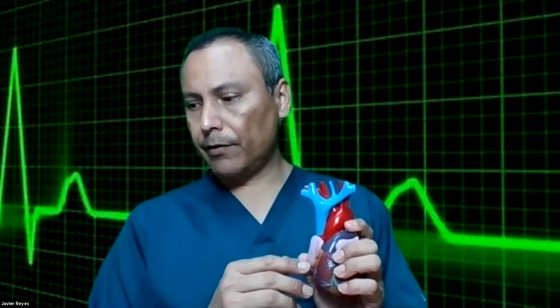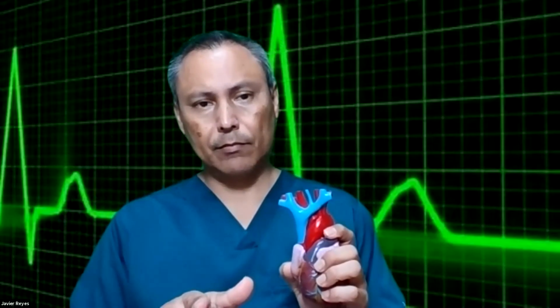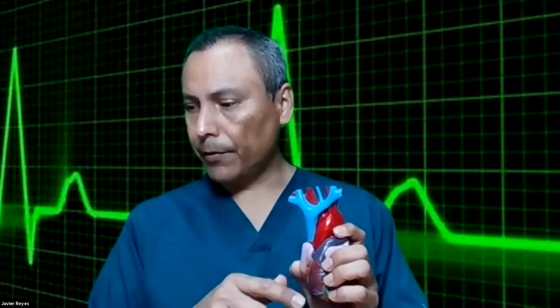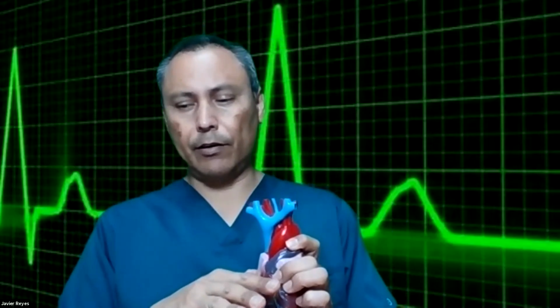So is the rhythm going to be regular? It should be. The P to the P and the RR should be regular. Get your calipers, measure it regular. The rate should be between 60 to 100. The rate should not be affected. If it's affected, then we're dealing with another kind of block. We'll go into it. The P wave morphology is completely normal. P waves looking up, looking nice before the QRS, everything's looking good.